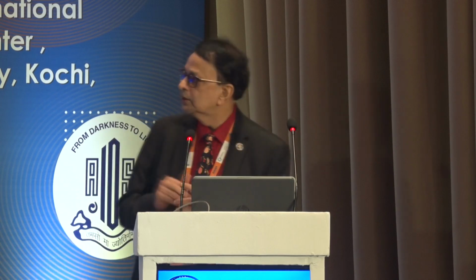Just to show you the different quadrants: in a medium cataract you can go for 4 quadrants. In a hard cataract, I go for the 8 quadrants or the octants. These are called the 4 quadrants. Then they have the sextants or the 6 quadrants, which is again very important. So these are the brown cataract. You can see here these are brown cataract. This is what we are talking about in this particular course.